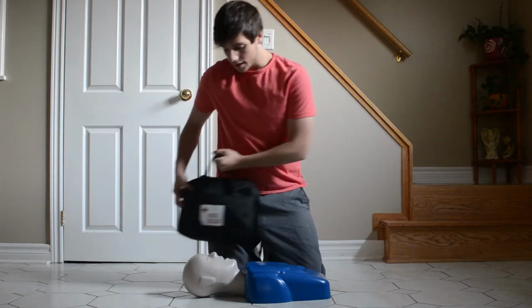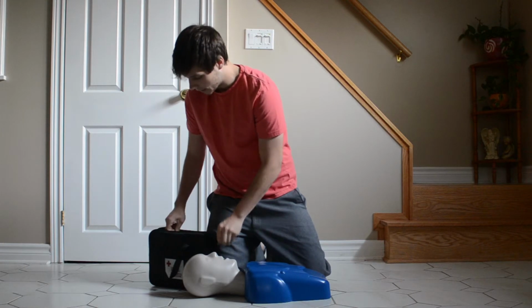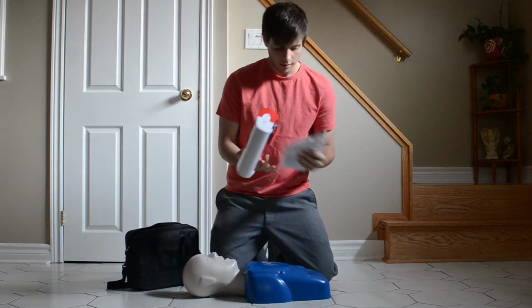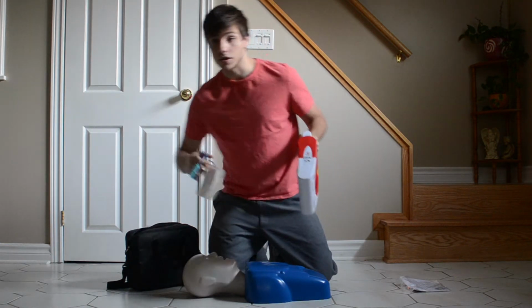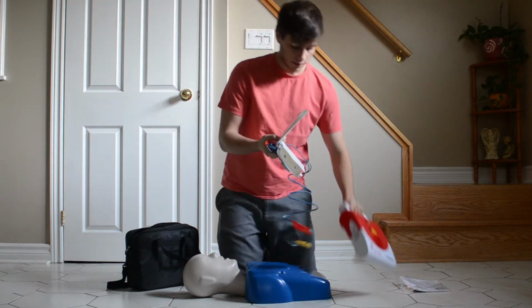So, let's say 911 is on the way. They're 5 minutes out, and I get an AED. So, I have my handy dandy AED right here. When it comes, it'll come in a little bag with a little first aid kit and the pads to help you out.